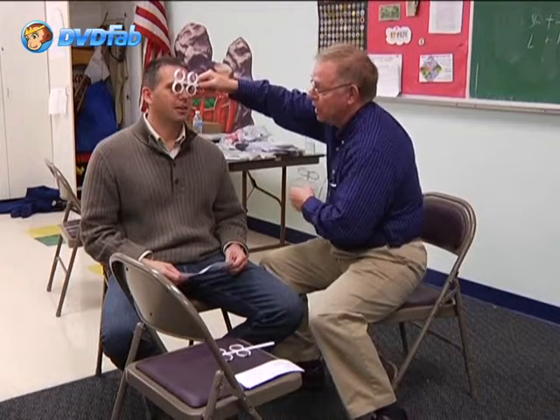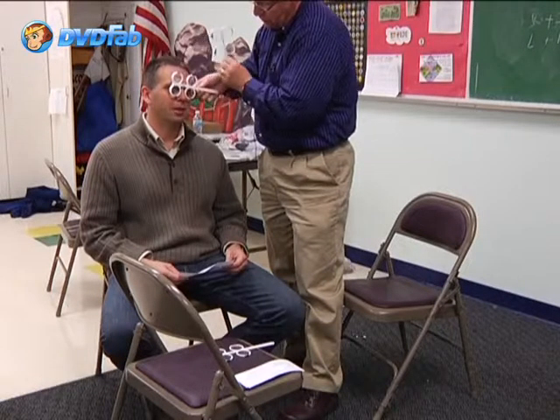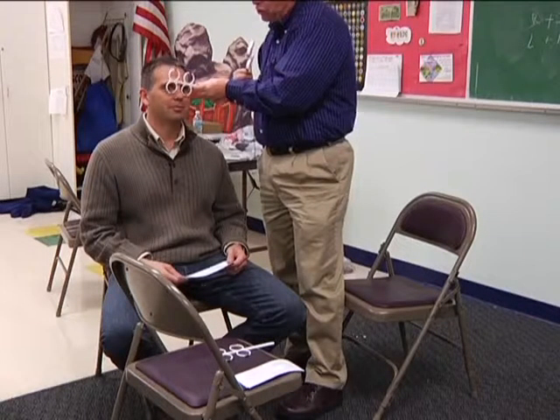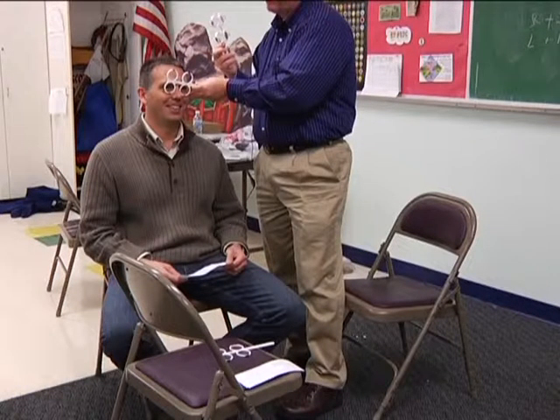Two. Okay. He chose the minus 1.25. Then I would say, okay, compare choice 1 and choice 2. One. He chose the 1.25. Does he need 1.25 or is he malingering? The age is for near, but this is distance, so he may be malingering. Let's find out. Compare choice 1 and choice 2. One. He chose 0.50. So therefore, out the door. You really just wanted a pen.